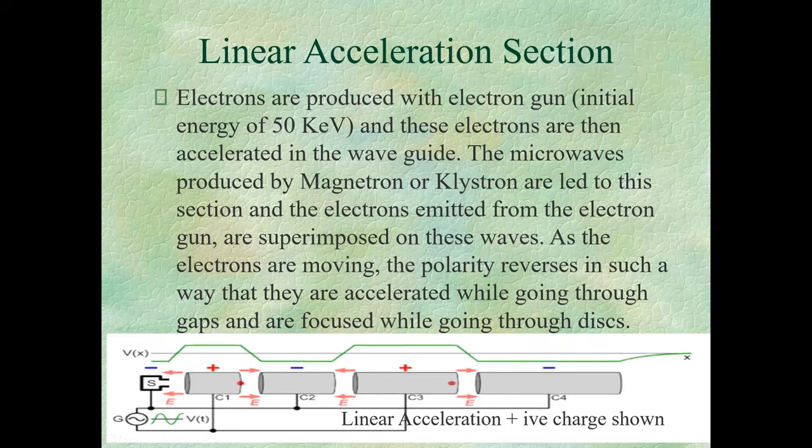If we are talking about photons, they are bombarded on flattening filters. These flattening filters are conical. You see the cone peaks in the center and then gradually goes down towards the sides. These flattening filters are used to make the X-rays uniform across the field. These days, flattening filter-free beams are also available and we use them. In the case of flattening filter-free X-ray beams, we move these flattening filters out of the path of the beam and the beam just goes straight. It does go through a scattering foil again, but it doesn't go through the flattening filter.